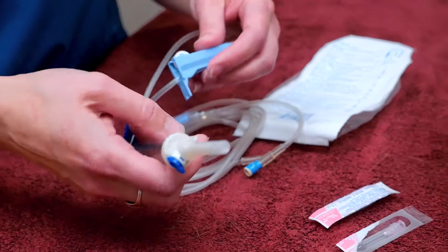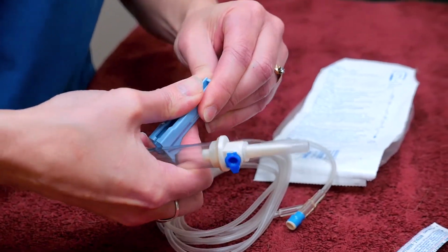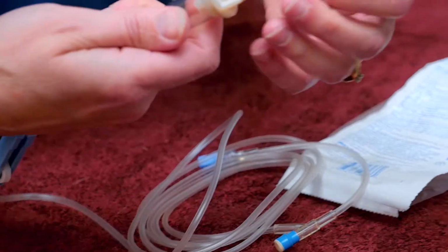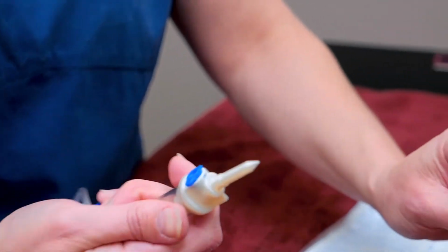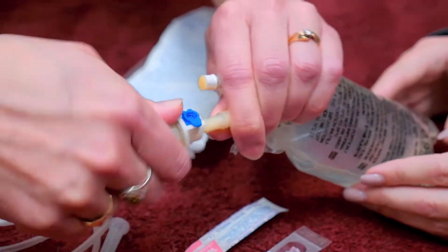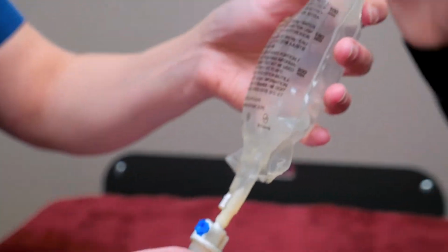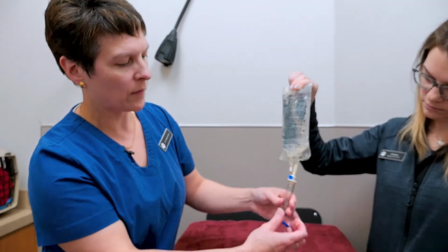The first thing you need to do is close off with this little rolling device here so that fluid does not run down the line and out the other end and make a giant mess for you. The next thing you're going to do is unsheath the pointy part that goes into the bag. And you're going to push that in just as far as it can go, twisting it a little bit so it gets a good seal there. And then ideally you have a hook or something that will help hold that so that you've got some gravity feed there. Chelsea's going to hold that for me for now.